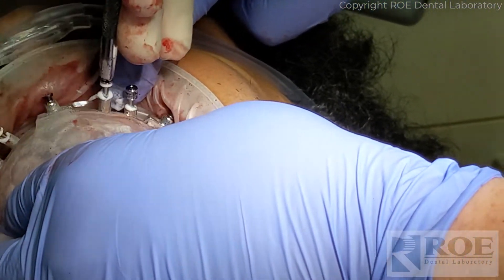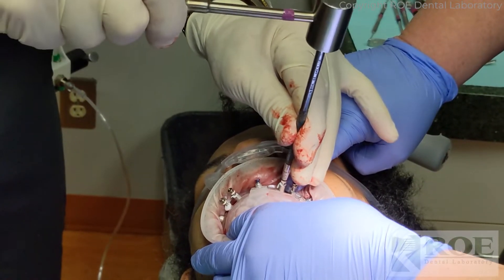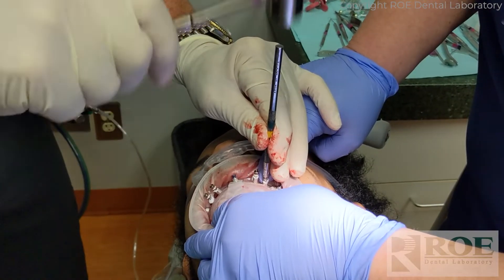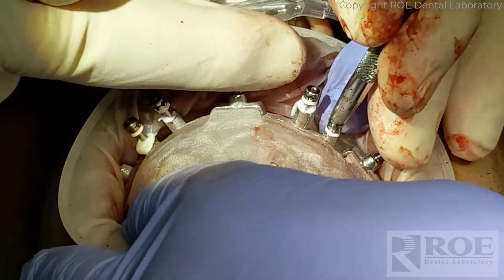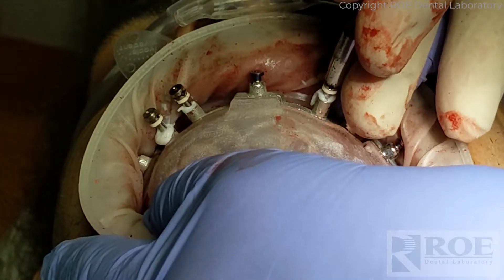Once all the pins are seated, use a surgical mallet and the end of a mirror or other instrument and tap the pins until they are flush with the fixation base. The audible low thud will change to a higher pitched sound once the pin reaches the metal. Repeat this process for all pins to successfully seat the fixation base for the next stage of surgery.